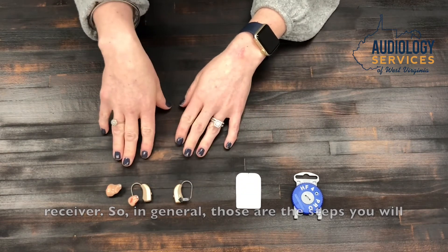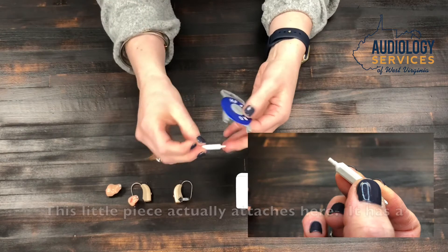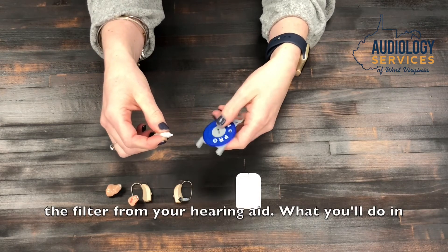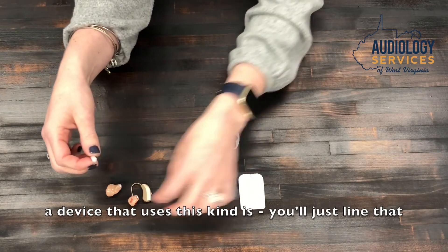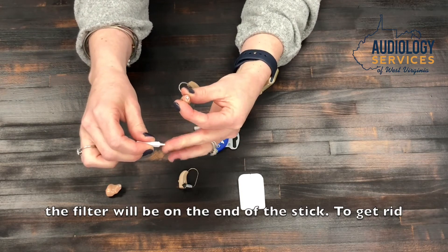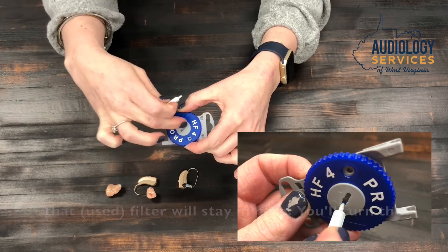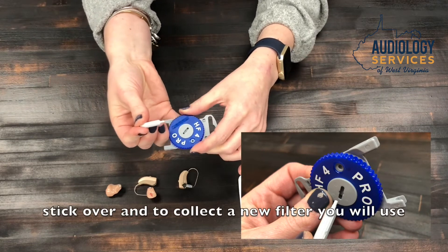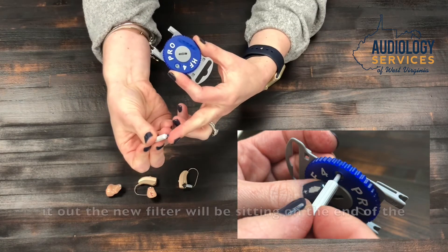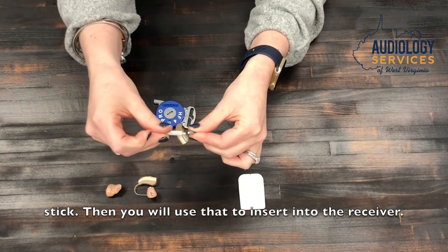Some manufacturers use a different tool — a small piece that attaches to a stick with a threaded end, which you use to collect the filter from the hearing aid. Line it up, turn it into the filter, and pull out — the filter will be on the end of the stick. To discard the old filter, place it in the center of the case and pull to the side. Turn the stick over, use the dial to collect a new filter, press it in, and when you pull out the new filter will be sitting on the end of the stick ready to insert into the receiver.